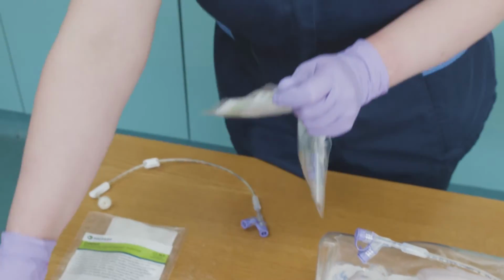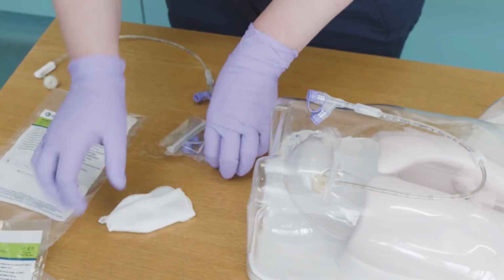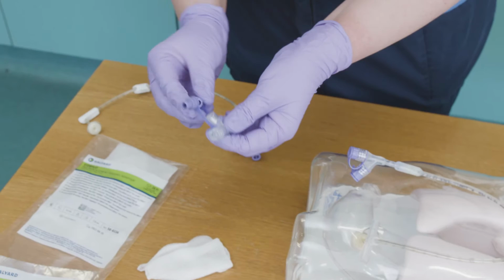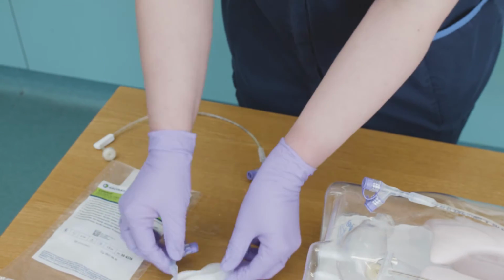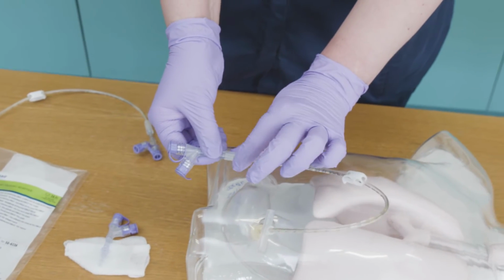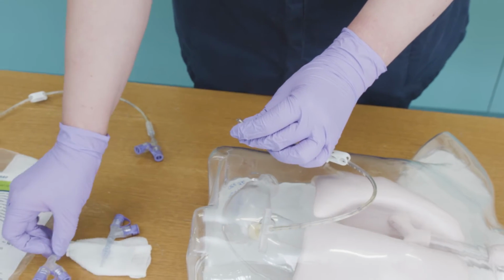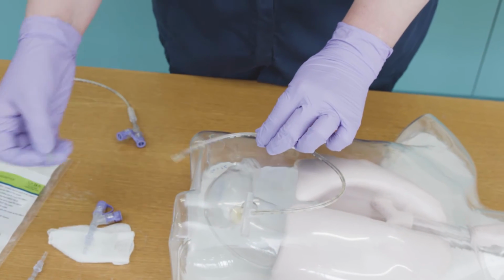Open the new Corflo Y adapter and untwist the skirt from the Y adapter. Untwist the skirt from the old Y adapter and move down the tube. Gently remove the Y adapter from the PEG tube by pulling gently. Then remove the skirt from the PEG tube.